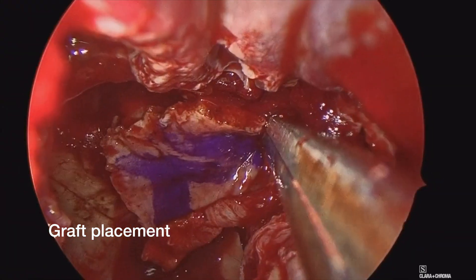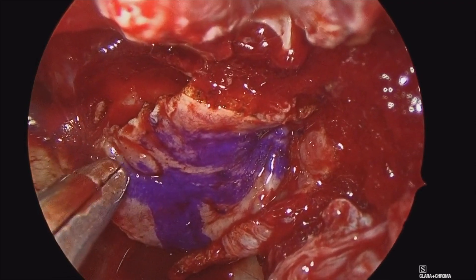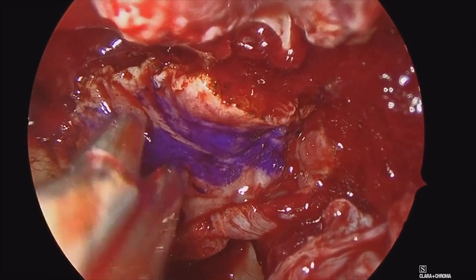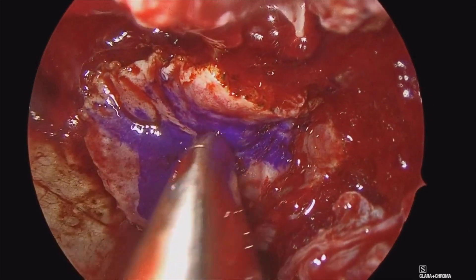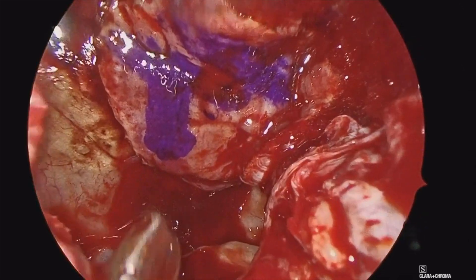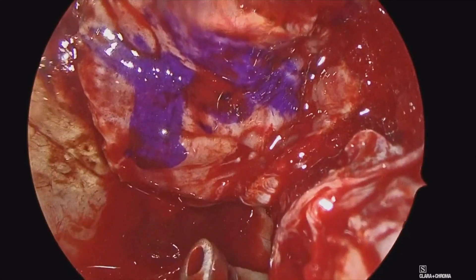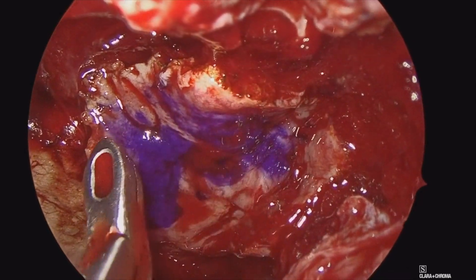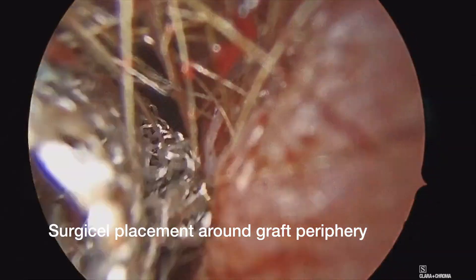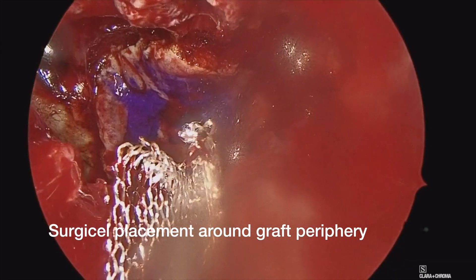So once it's out, I mark this mucosal surface with a marking pen. Here we are bringing it back into the nose. Previously, all the mucosa has been removed from around the sella, which is really important to have a nice exposed bone and dura for this to adhere to. Once this is in place, we'll carefully position this and unfurl the edges. As you can see, this can reconstruct the entirety of the sella, including the clival recess and potentially onto the planum. So it is a very nice large graft which has great coverage.